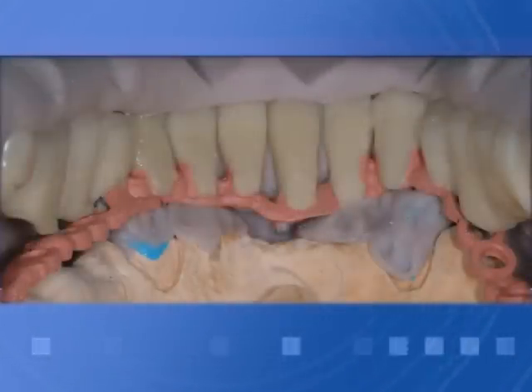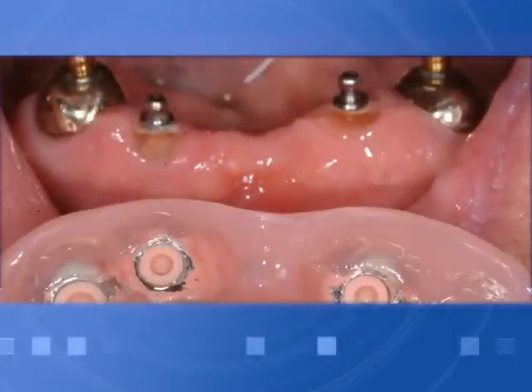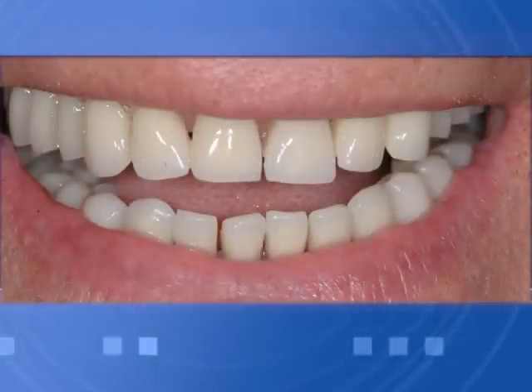With this simple OT cap technique it's possible to make stable and strong quality dentures with time and cost savings, especially with expensive materials like investments, silicones, and so on.